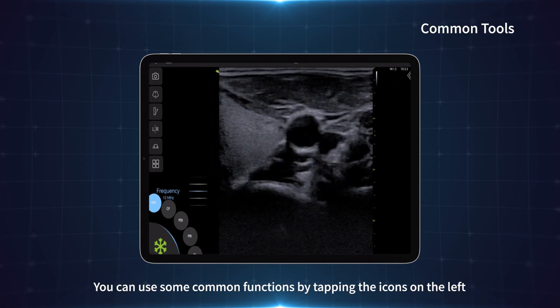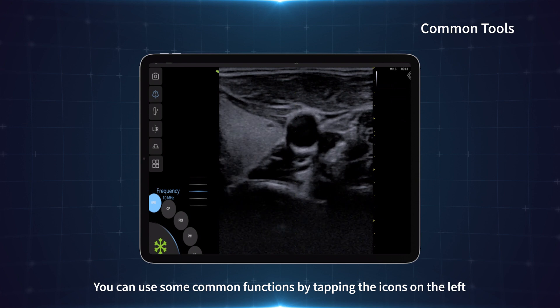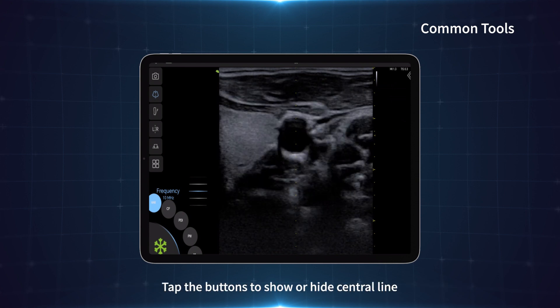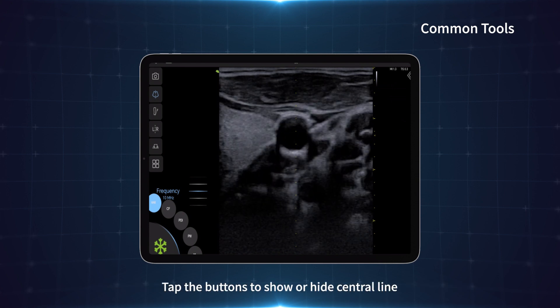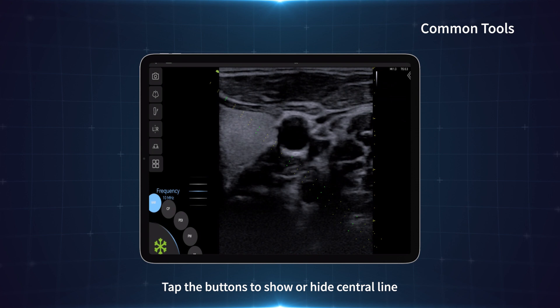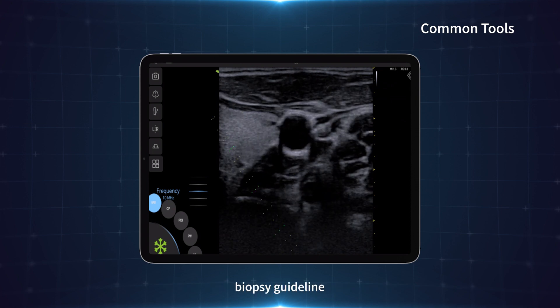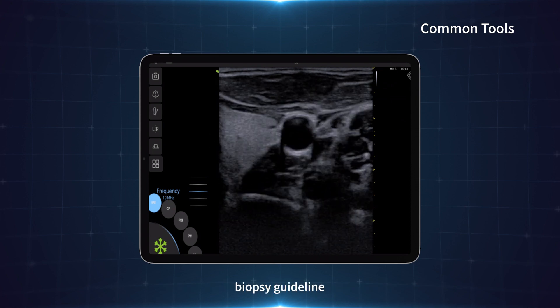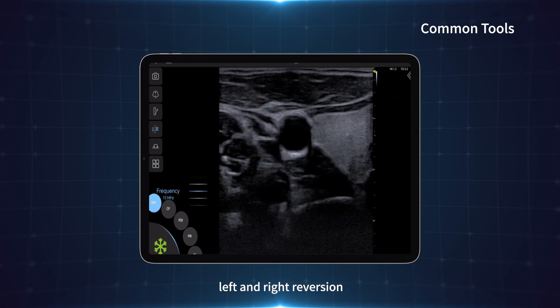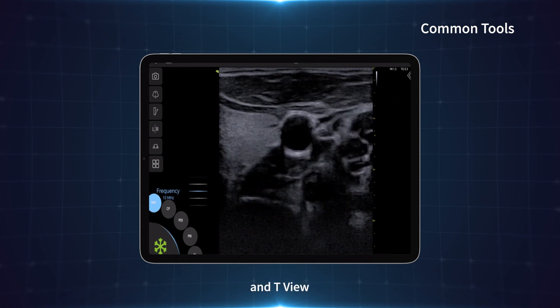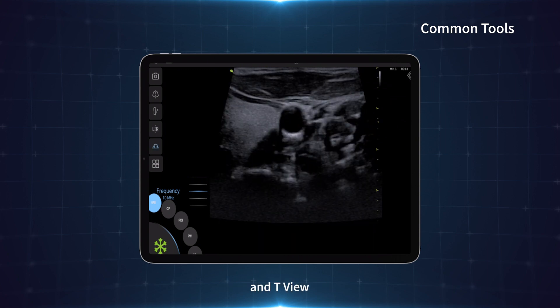You can use some common functions by tapping the icons on the left. Tap the buttons to show or hide the central line, biopsy guideline, left and right reversion, and T View.